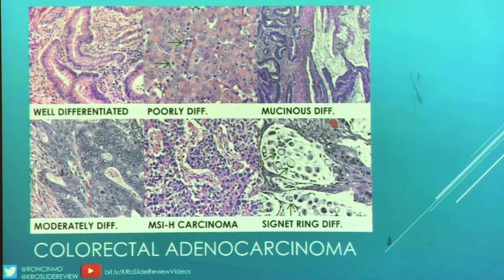And I'm not really seeing tumor budding. It's okay. Yeah. That's unfortunate. And I honestly didn't think to look for a picture of that, because it's a good question.